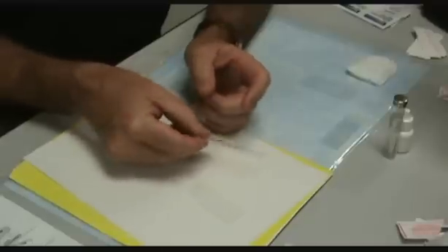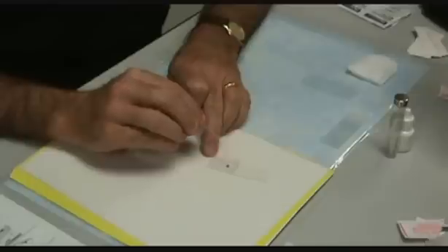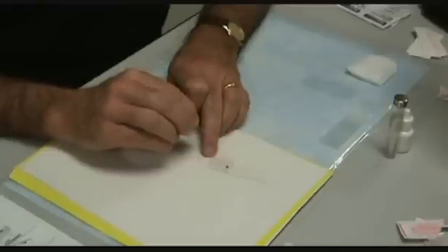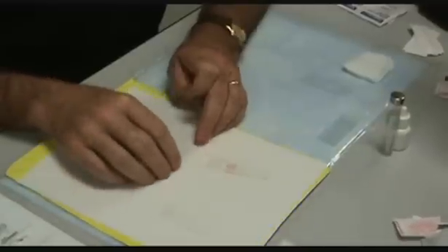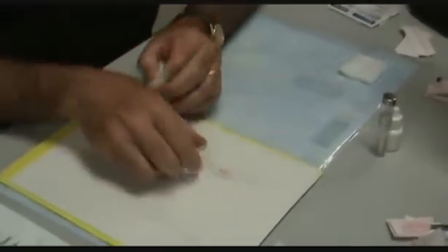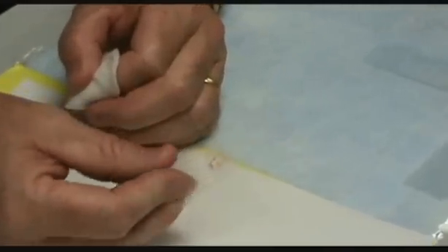For starters, we're going to put one drop right there. And then the way you do this is you take your other slide and you back it into that drop, and as soon as you get it, you feather it out like that. Now, you can see there — that is a not well done thin smear. The reason that it is not well done is that the slide was not adequately cleaned and the blood beat it up. It points out the importance of having very well cleaned slides before you do this.